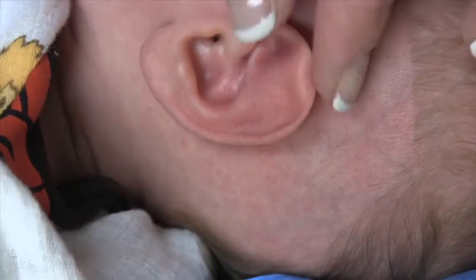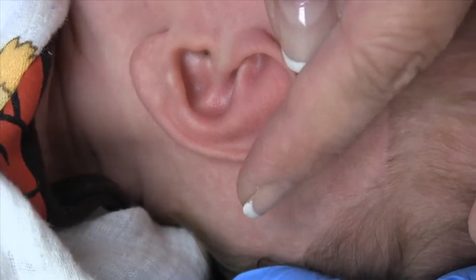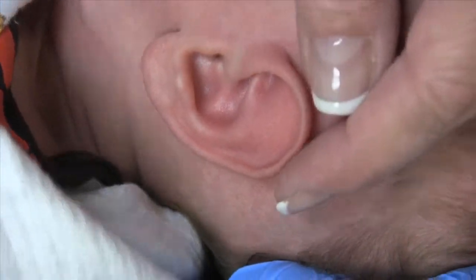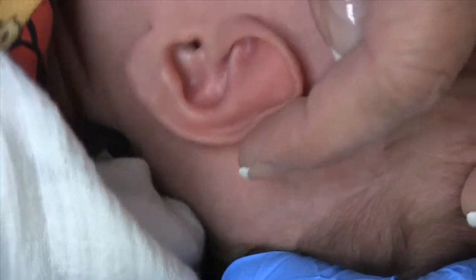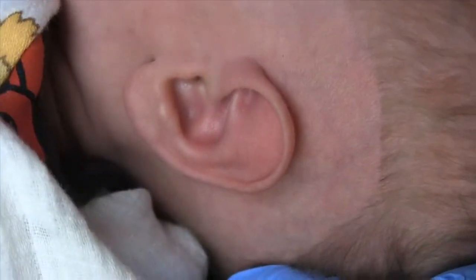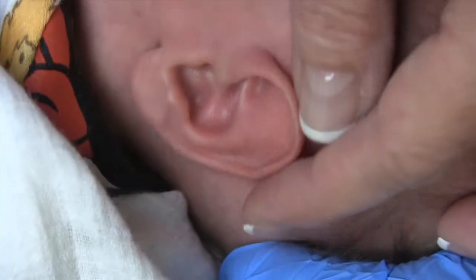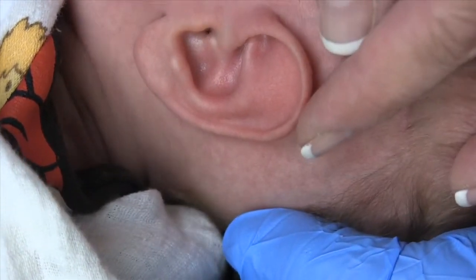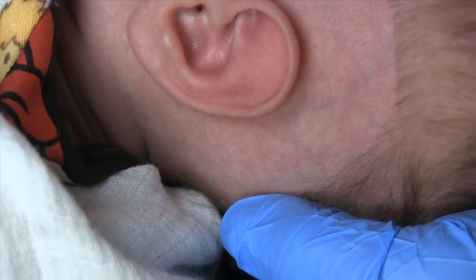So we need to roll this rim in at the same time that we are supporting that superior crus. We're going to be using our ear well as a base plate, and that will be the basis of utilizing the moldable silicone impression material to create a customized prosthesis for this little one to meet his exact needs.